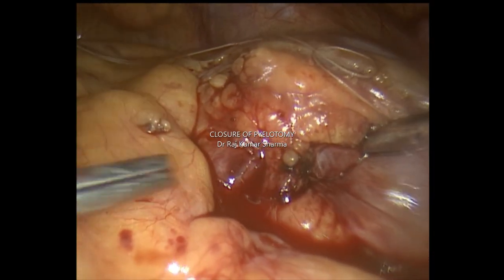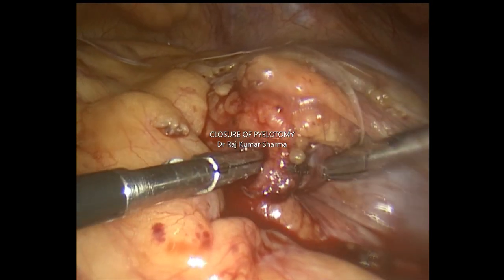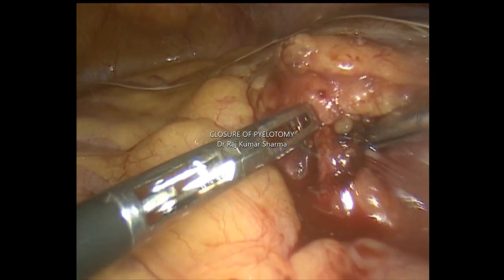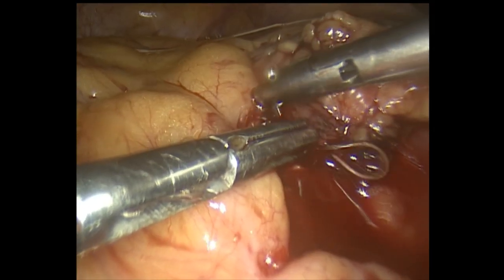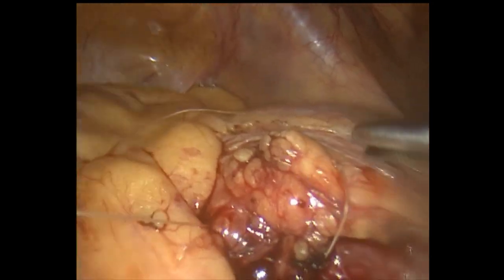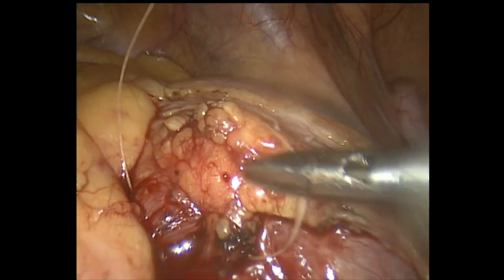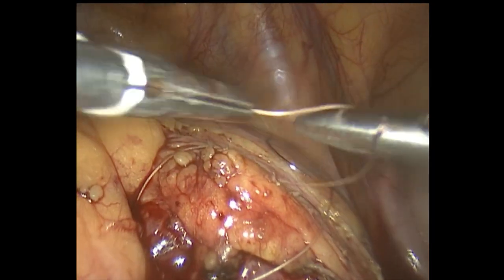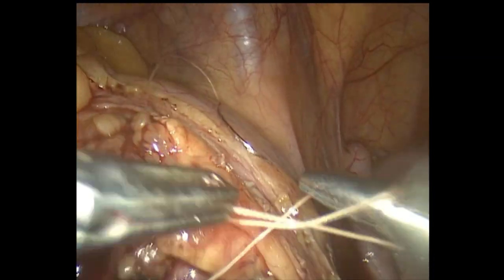I am stitching with the help of 3-0 vicryl suture. A single stitch is enough for this type of case.